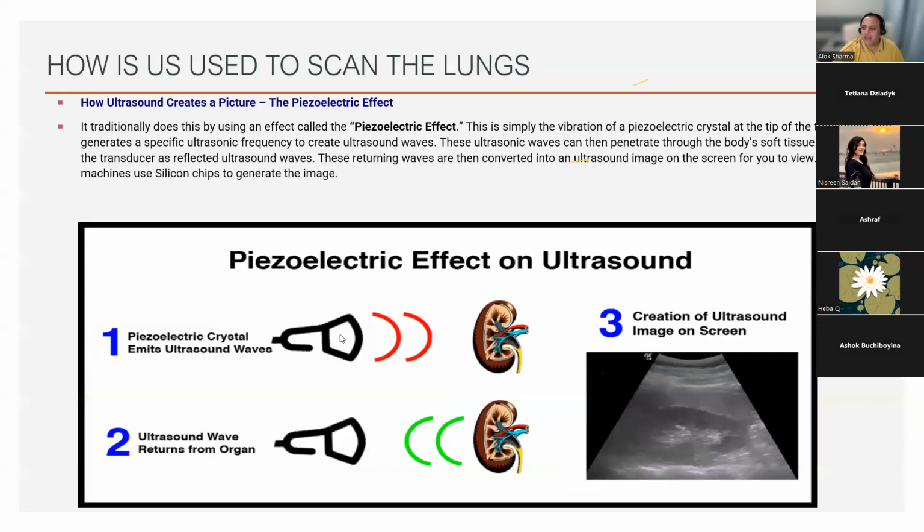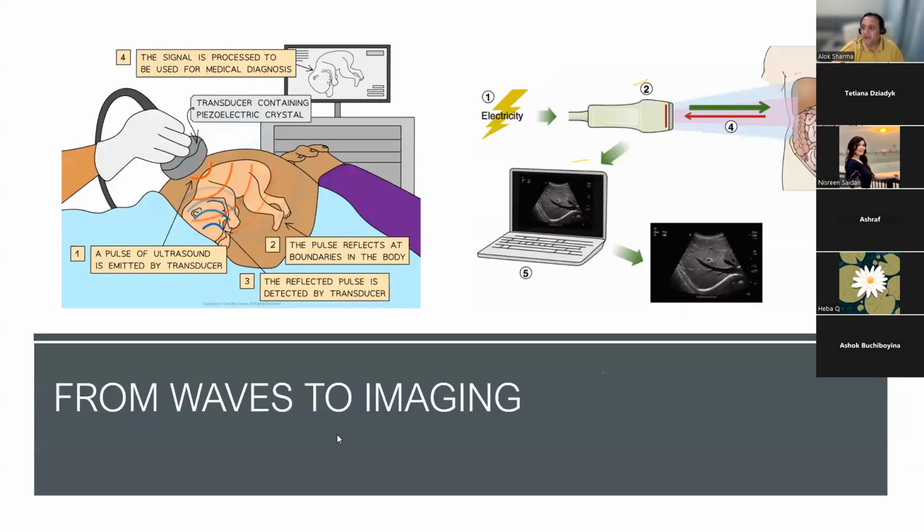Now, at the end of the day, when sound waves interact with tissue, they generate waves which go back into the probe and return to the machine. And eventually, when they return to the machine, through algorithms, it interacts with whatever sound waves are returning to produce an image that we see on the screen, which produces different amounts of grayscale depending on the tissue with which it's interacting.